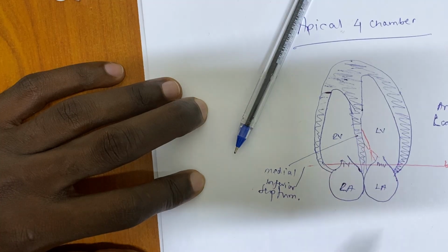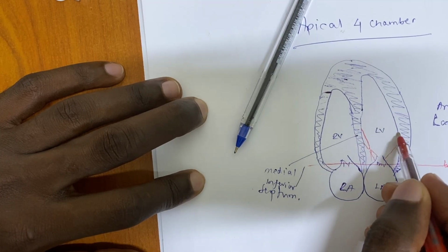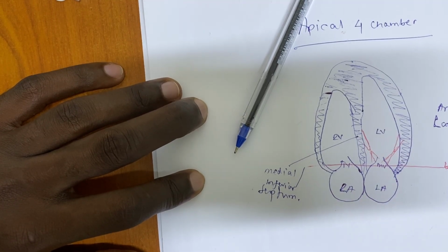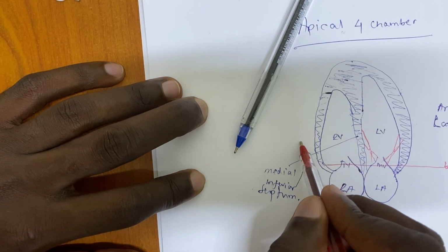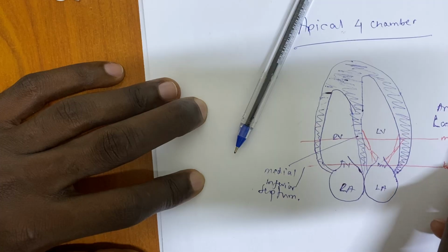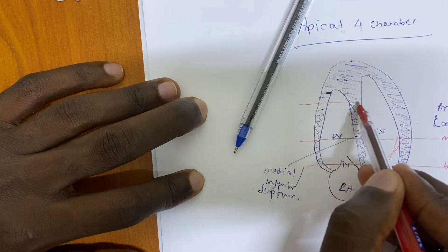Maybe this papillary muscle we can also see in this view. So if you cut a papillary muscle, then this is mid.